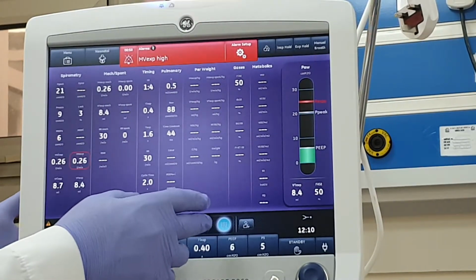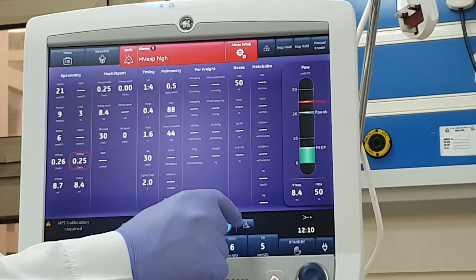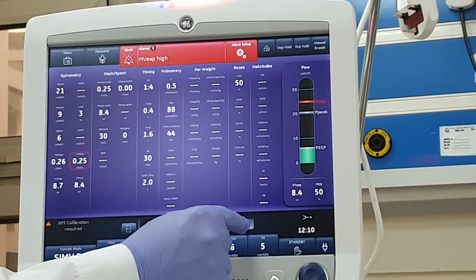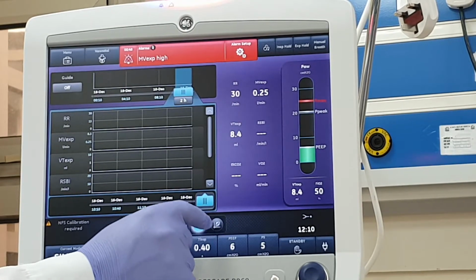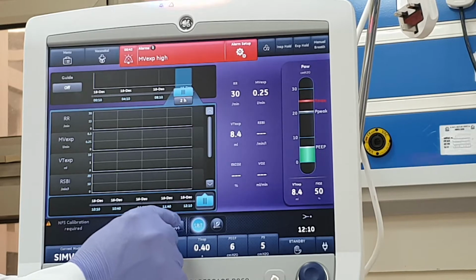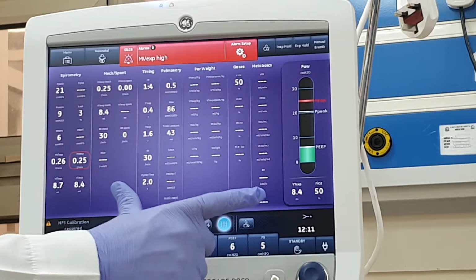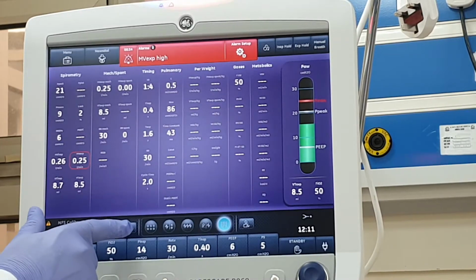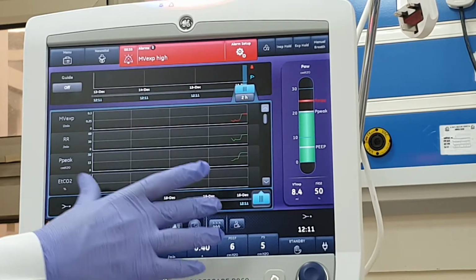If you want to go to the future, it's expandable. Those squares, if you hit the square, it's gonna expand, as you can see. And if you hit this one in the middle, the future gonna close and the present gonna expand and open. If you wanna go to the past, you basically hit this one, it's gonna expand.